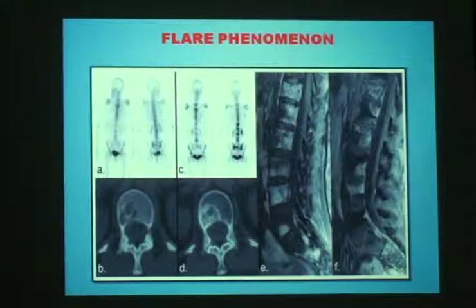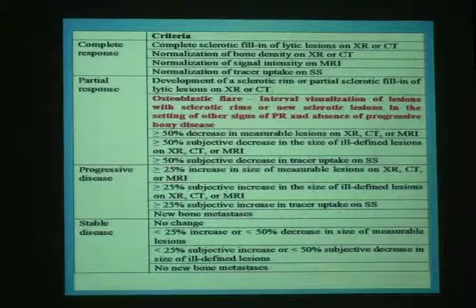This is actually a response to therapy, or an attempt of the bone to heal by forming new bone, by sclerosing. And so this osteoblastic reaction could be misinterpreted as a progression of the disease process, where actually, according to the RECIST criteria, it is considered a partial response.